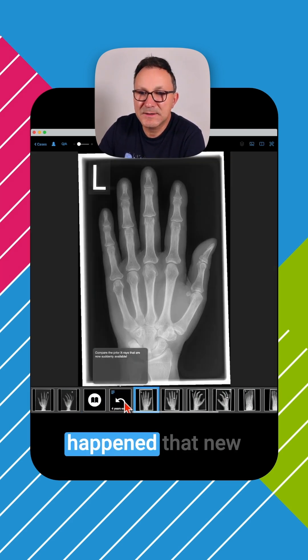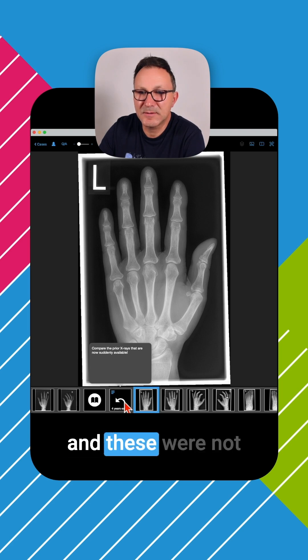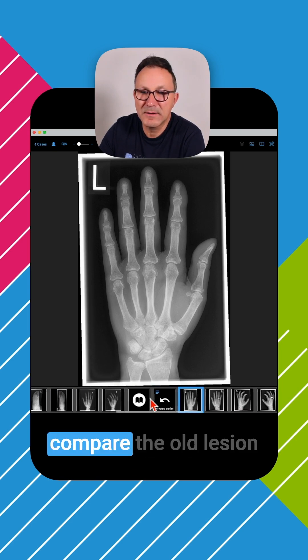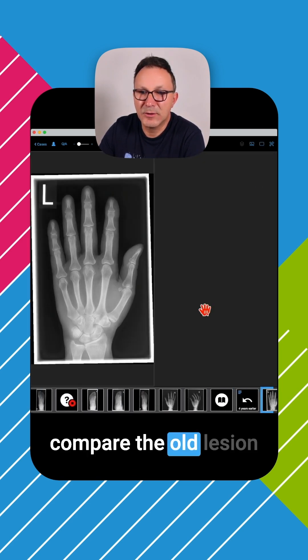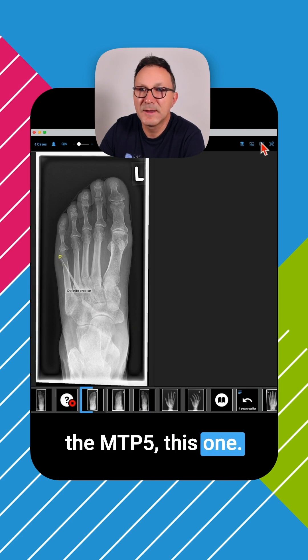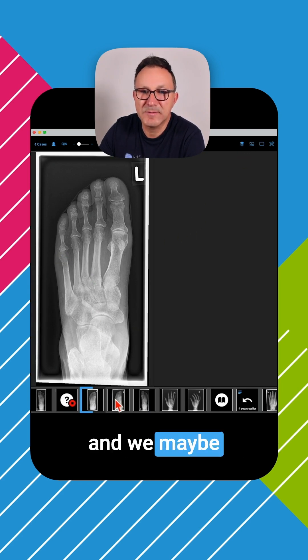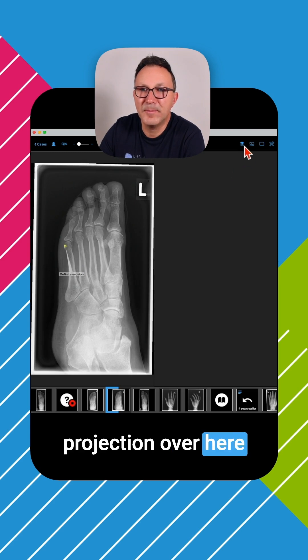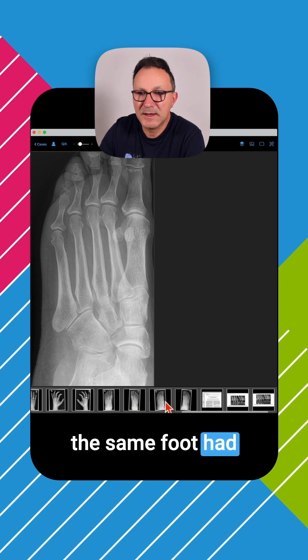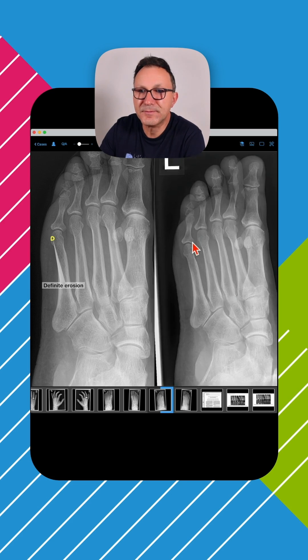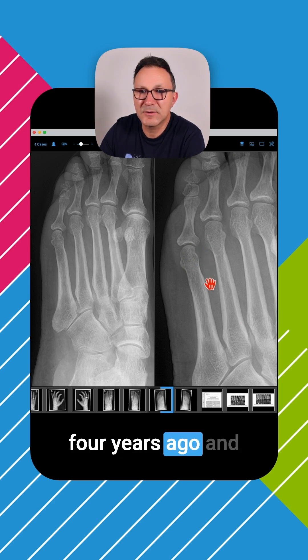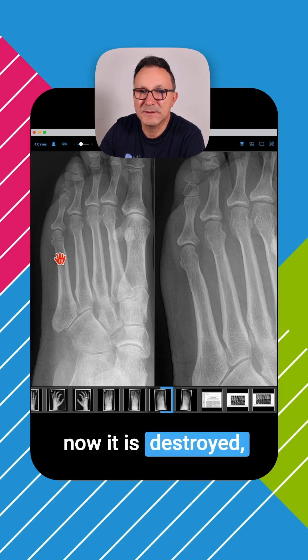In addition, new X-rays appeared — not actually new X-rays, but old X-rays that the patient made available. So we can now compare the old lesion at MTP5 using the oblique projection. Four years earlier, the same foot had a normal appearance — so you see that everything looked as it should four years ago, and now it is destroyed: confirming it is an erosion.